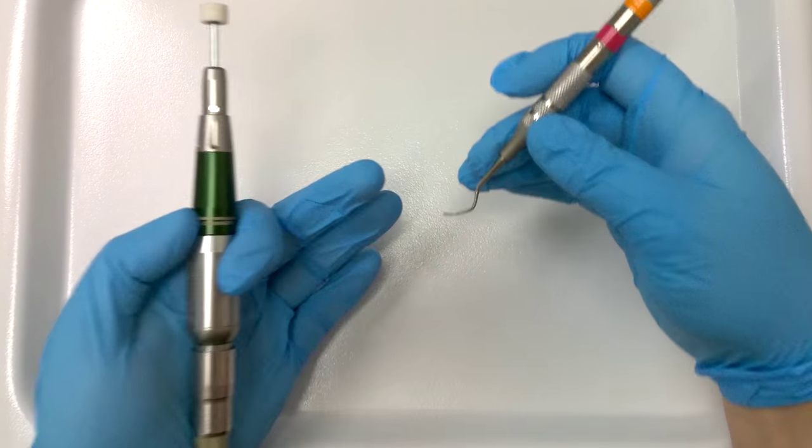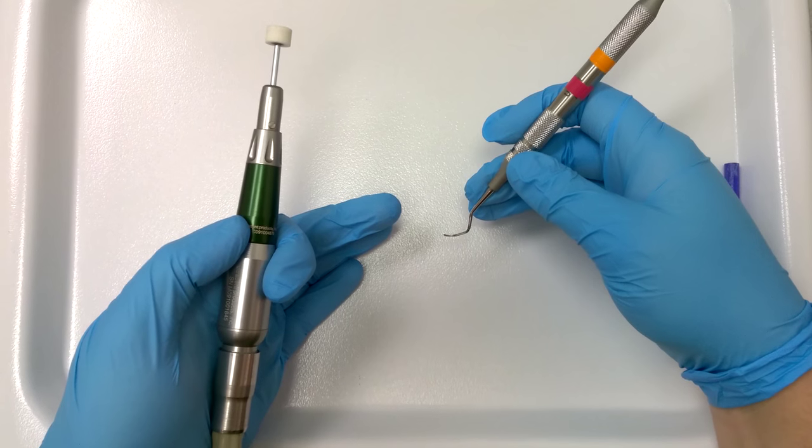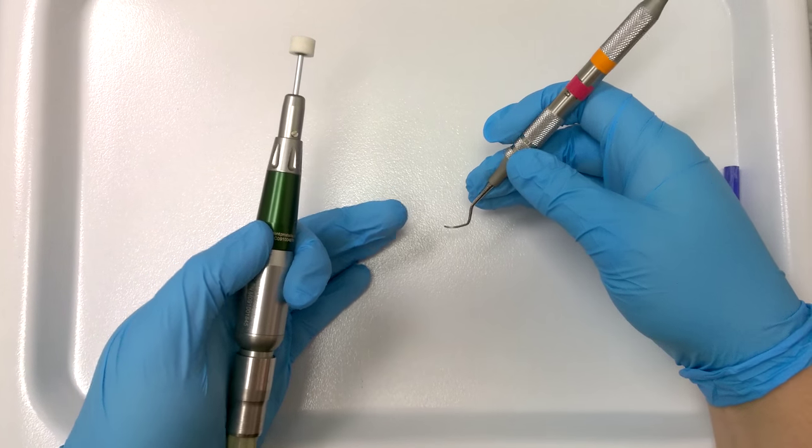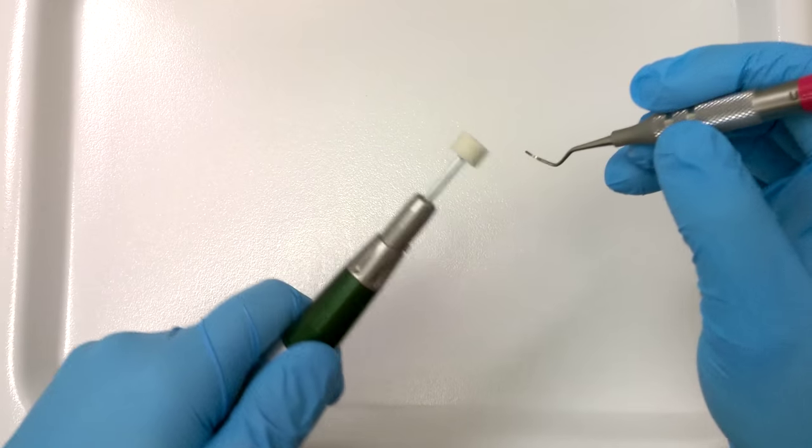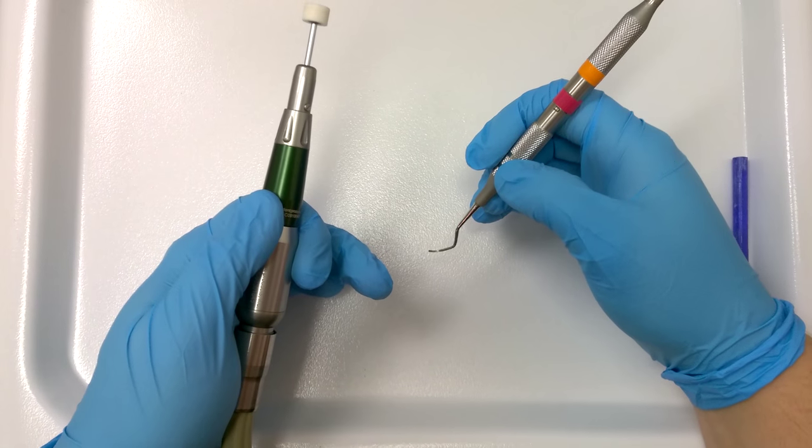What you want to make sure you do is make sure both of your hands have a fulcrum, so you're doing this over your tray or your table or something. We don't want to just be free floating in the air because you tend to slip. So make sure you have two fulcrums.